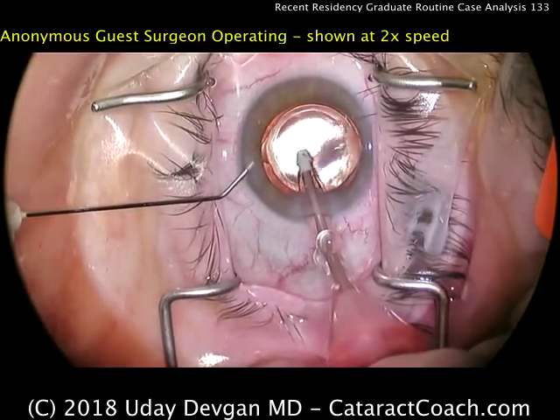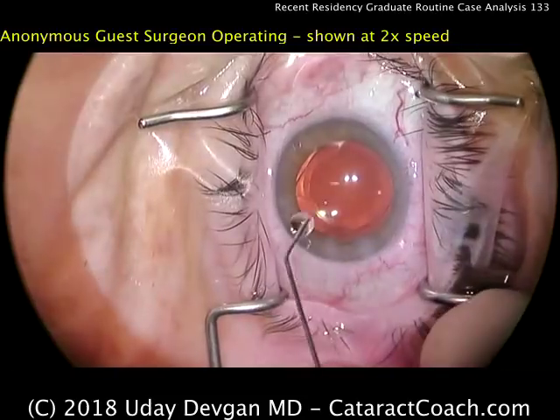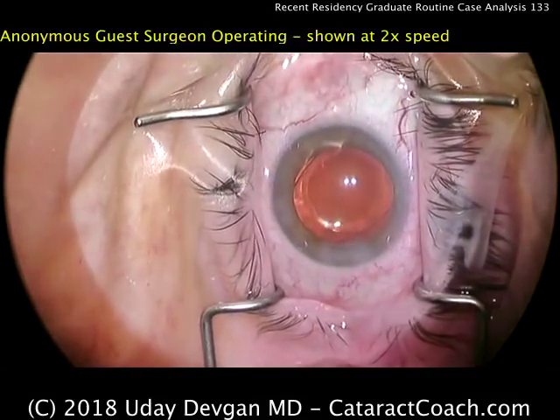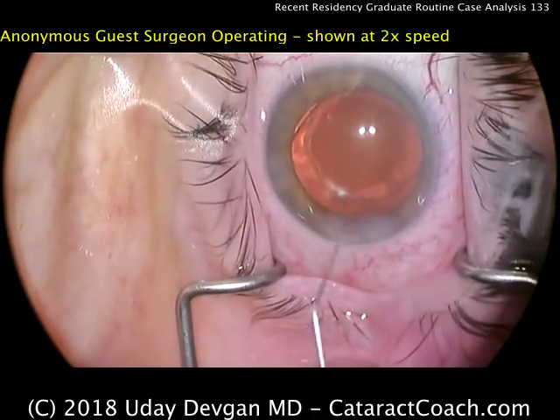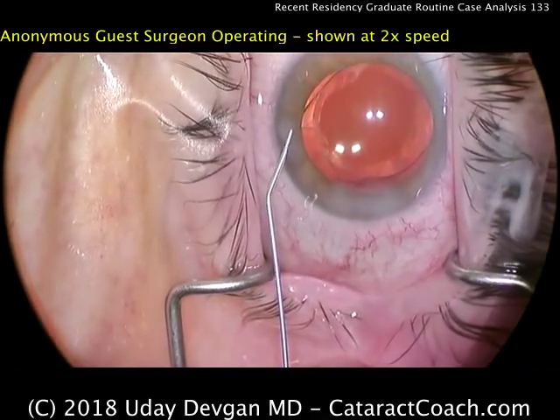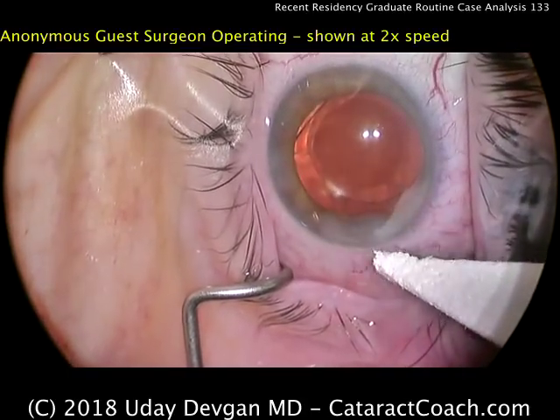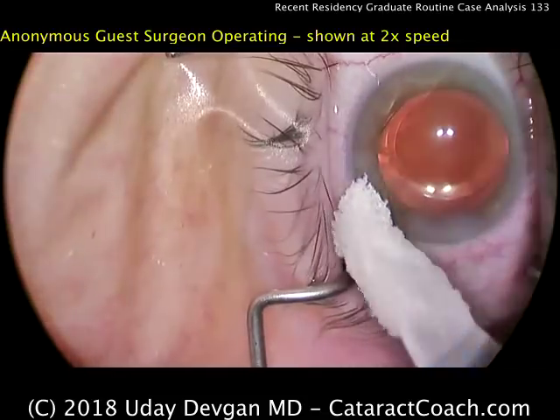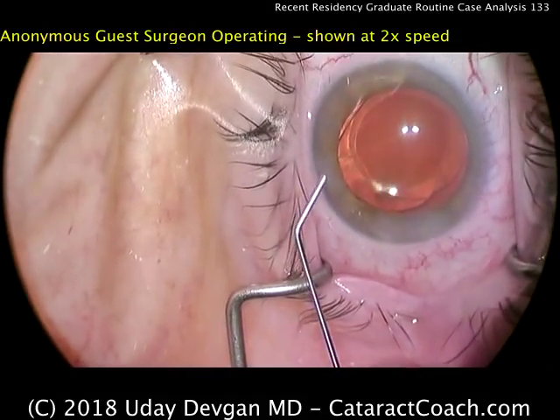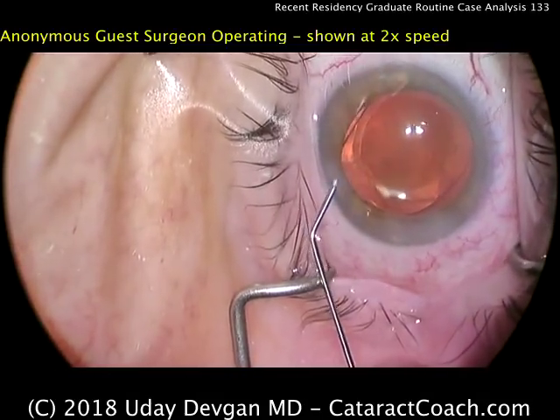Preventing the anterior chamber from collapsing by injecting balanced salt solution. Time for hydration of the main incision. So all in all, this is a beautiful surgery — this young doctor is doing great, and I anticipate it will only get better in the future. For this level of training, which is probably only a few hundred cases of experience, I think this was certainly an A-quality surgery. Congratulations to this young doctor — and you too can submit your video anonymously at CataractCoach.com.